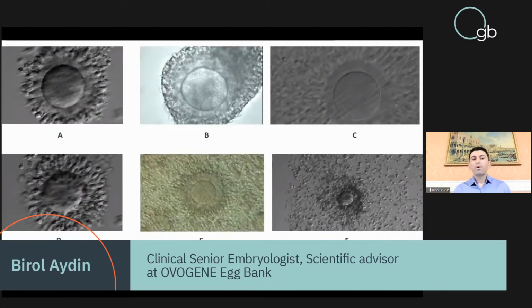If we talk about cumulus oocyte complex morphology, as you know, publications show no correlation between cumulus complex morphology and fertilization, blastocyst rate, and clinical pregnancy. But the egg banking situation is a bit different. There are different images, as you see, and all of them have a different cumulus complex morphology. Some of them are easy to clean during denudation by hyaluronidase enzyme, but some have really thick tissue, and it's really difficult to clean them.